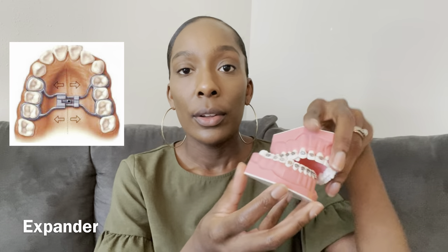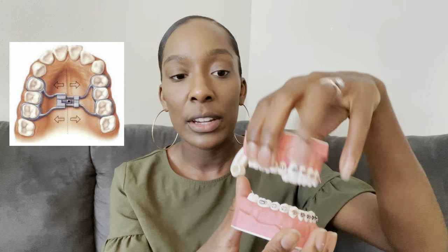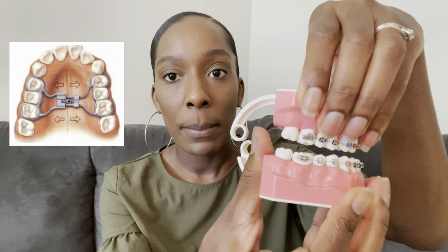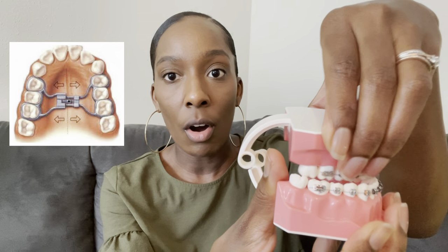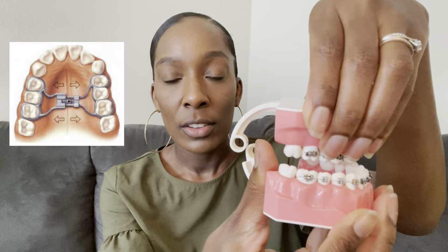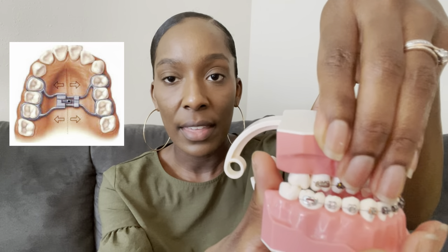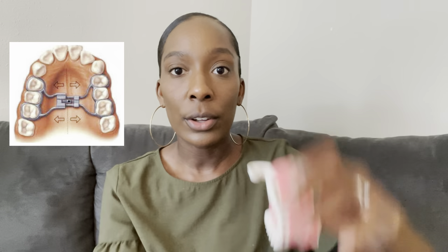The next orthodontic appliance is called an expander. Some patients come in and their palate — the roof of the mouth — is really shallow. When it's shallow like that, the teeth can be really crowded and the bite can be off, with teeth more inward instead of properly aligned. So when the upper teeth are inward and the palate is really shallow, you will make an expander for the patient.